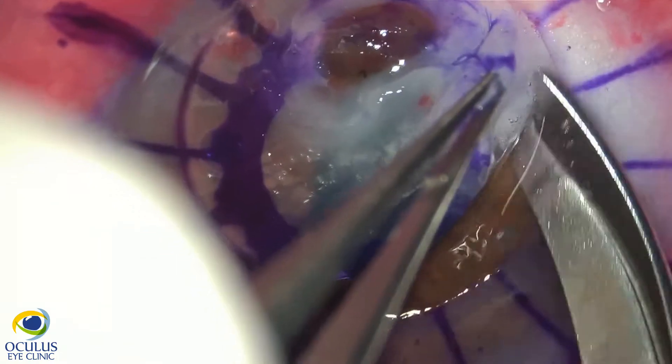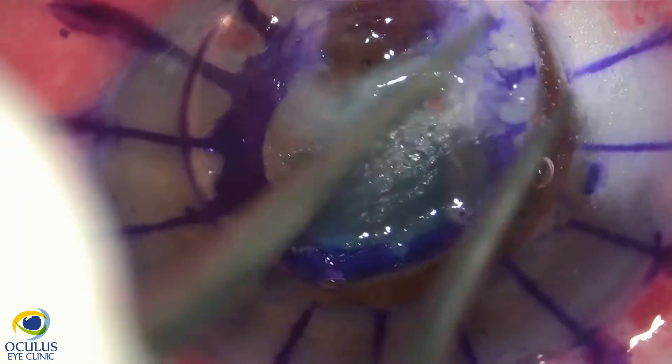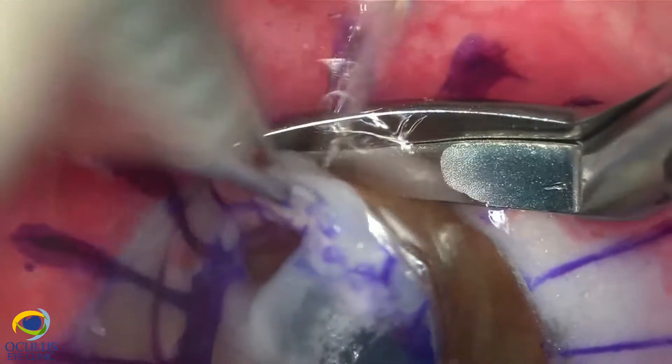We cut the cornea with corneal scissors, paying a lot of attention, slowly step by step, taking extra care especially in the perforated area of the cornea where we have some new vessels which are bleeding.